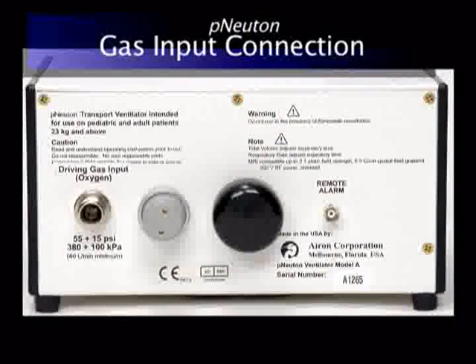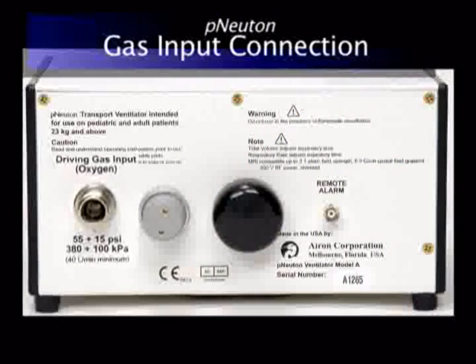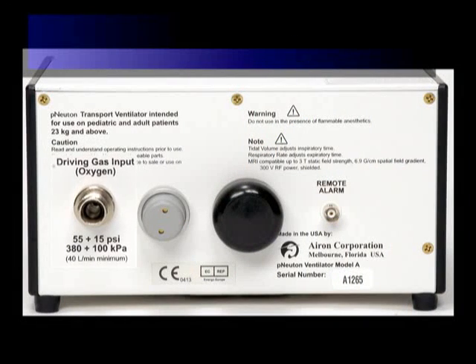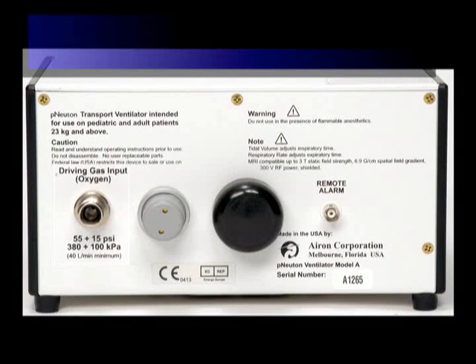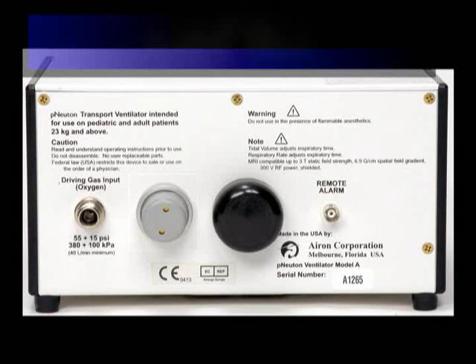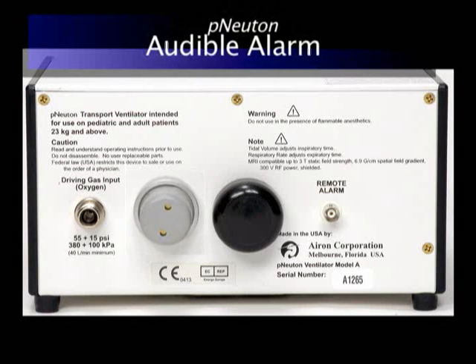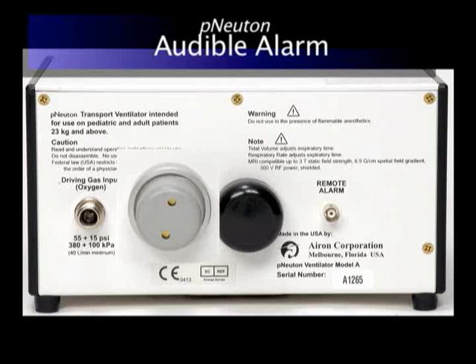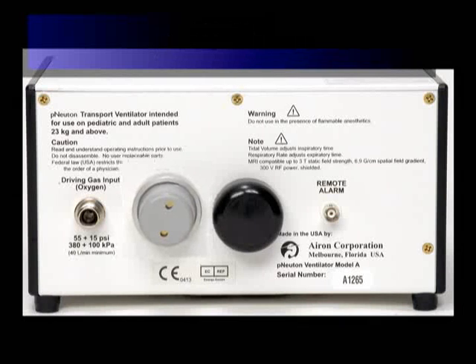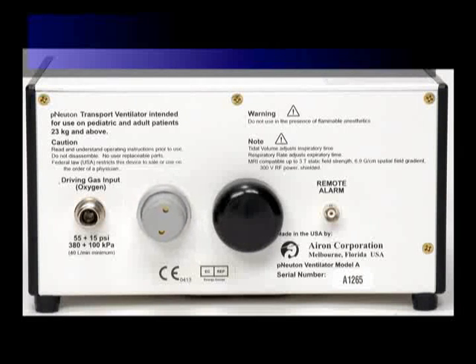Let's start with the features and controls of the rear panel. Here you have your gas input connection. It requires connection to a high-flow oxygen source of 55 psi. The audible alarm alerts when a patient disconnect has occurred or when oxygen source gas pressure drops below 30 psi.